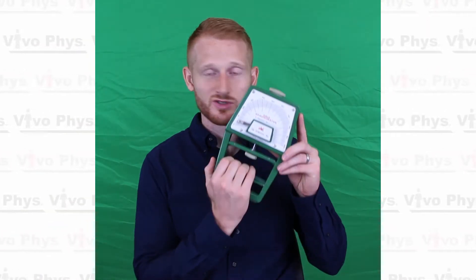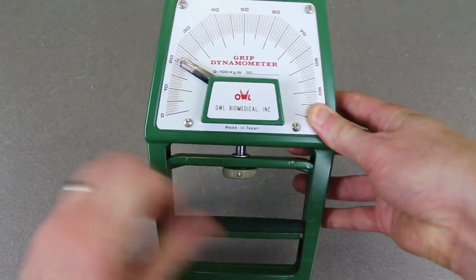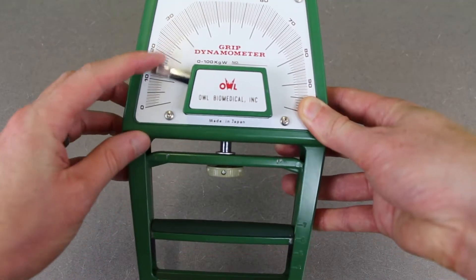When you squeeze the hand grip dynamometer, you're going to see the needle and the dial start to go up. This one is measuring in kilograms. In order to do the next trial, you need to push that needle back down to zero so you can do it again.